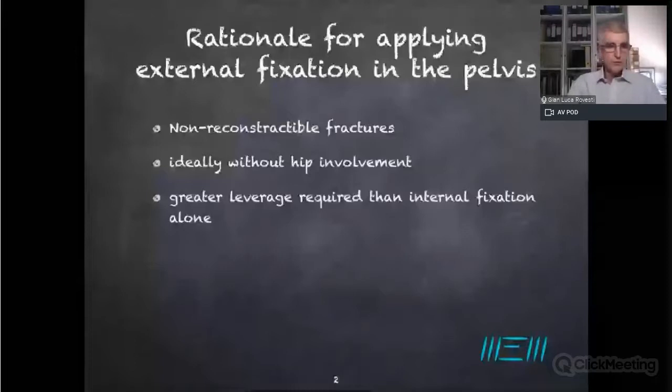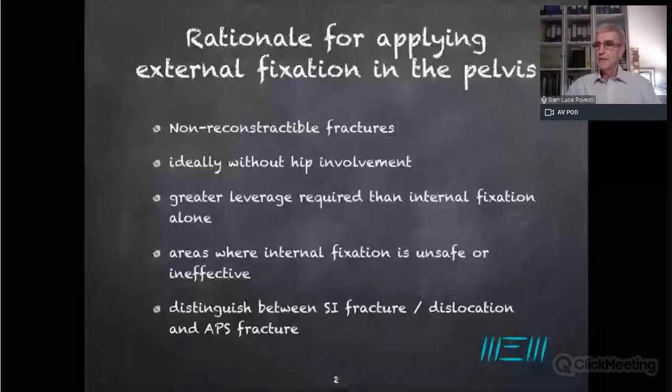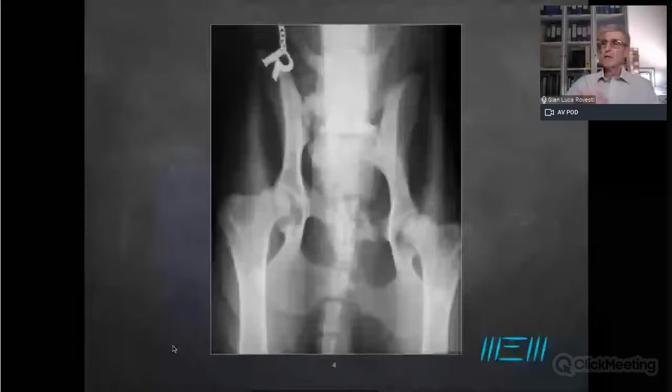To treat fractures in areas where the internal fixation is unsafe or ineffective. And we can see the most classical example of this when we have to deal with fractures of the articular process of the sacrum, that should not be mixed up with the fracture luxation, fracture dislocation of the sacroiliac joint. What do I mean? This kind of situation, as you can see here, is not just a fracture luxation of the sacroiliac joint, but it's a true fracture here. This piece of bone here means that we have a real fracture of the articular process of the sacrum.